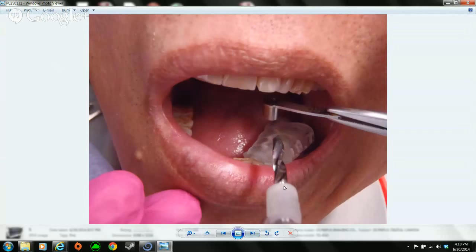And using a master tube, same thing, same protocol. Using Blue Sky's master tubes and a key. That way we could step up, because this was very dense bone. So we had to use, I think, 3 drills on this one.